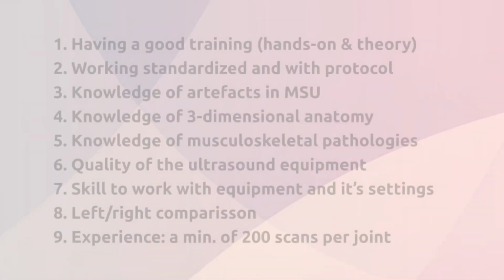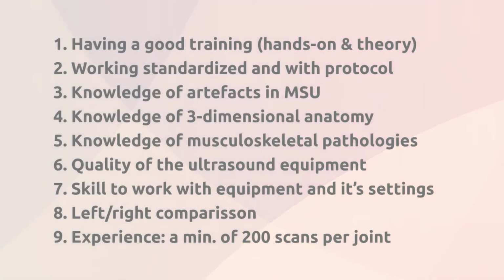MSU comes with a high general diagnostic value, equally to MRI. The high diagnostic value of ultrasound is strictly related to a few important criteria. MSU's diagnostic accuracy is not profession dependent, but user dependent. Anybody can do it as long as they fit the criteria described on this slide. But only as they use MSU a lot, since there is a long learning curve. This long learning curve goes for every profession.